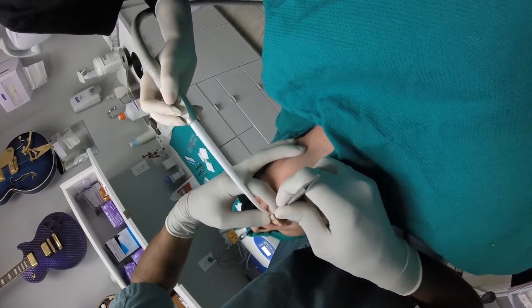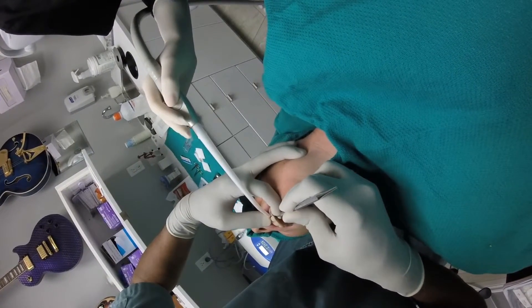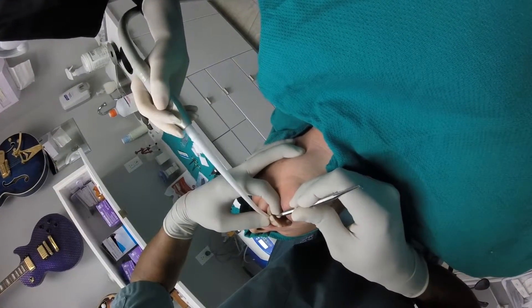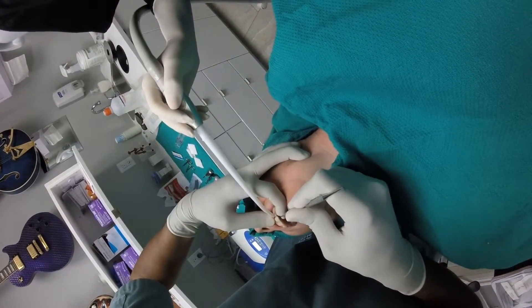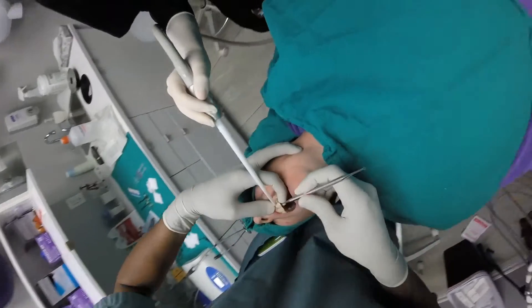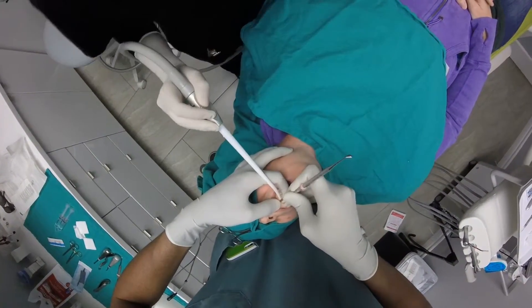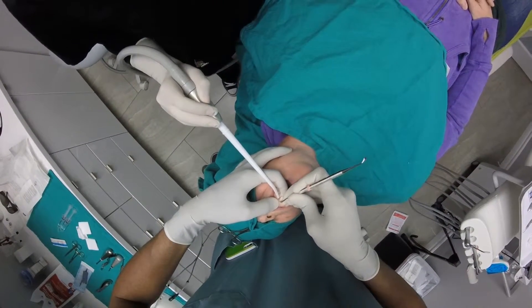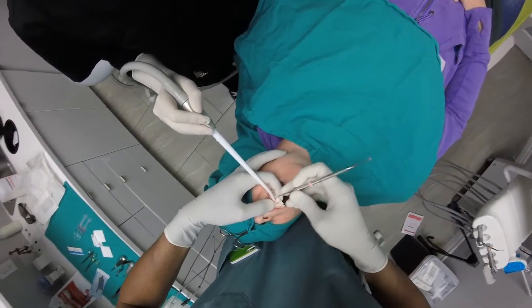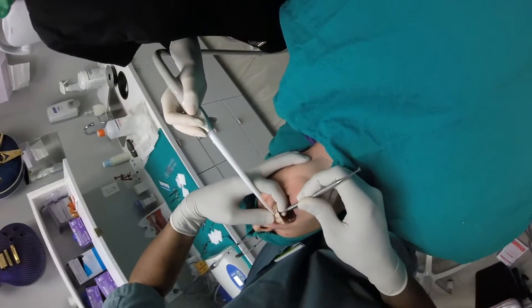The nice thing about this is it helps, in a progressive manner, get this tooth out as minimally traumatic as possible. You'll also notice in this video that I have my index finger and my thumb on the patient's alveolar ridge. This is a technique I learned from one of my instructors in dental school, Dr. Howard Holmes, an oral maxillofacial surgeon, who told us that you can get a lot of proprioceptive information with respect to the forces you're applying on the patient just by putting your fingers on that alveolar ridge. So I have my fingers here giving me information about how loose this tooth is and when is the right time to take a forcep onto this tooth.